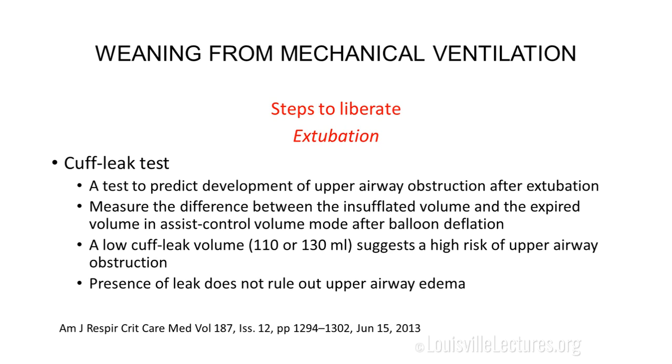So you deflate the balloon, you see how much is going in, so your tidal volume, and see how much is coming out. A low cuff leak volume, so 110 or 130, suggests a high risk of upper airway obstruction. So you want to make sure there's a lot of leak when you deflate the balloon. If there is no leak, then there's a higher chance of the patient developing edema. But the presence of a leak does not completely rule out upper airway edema anyway.